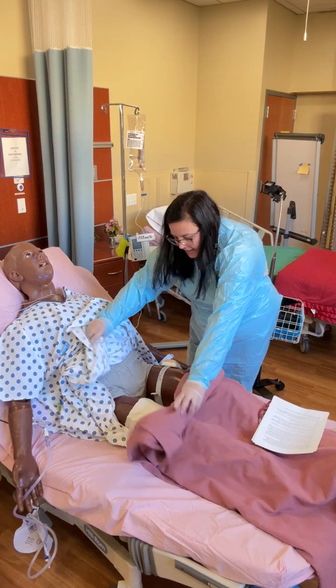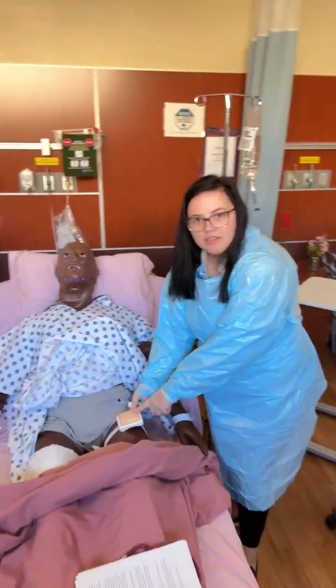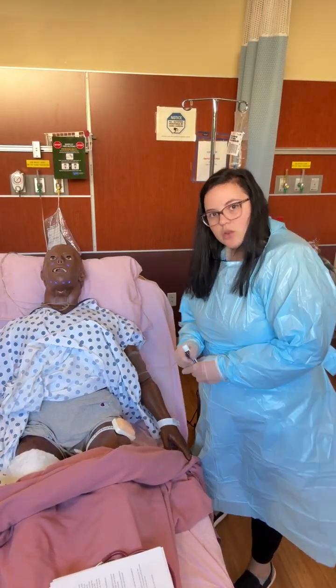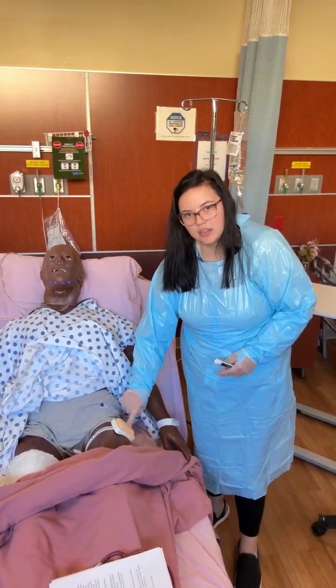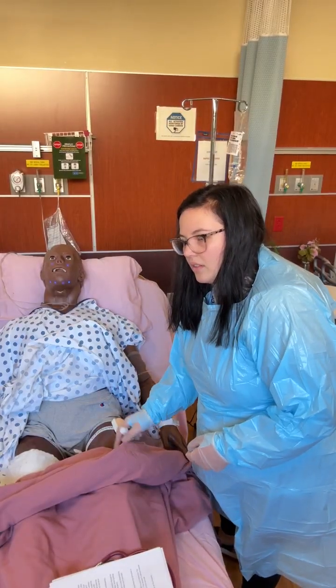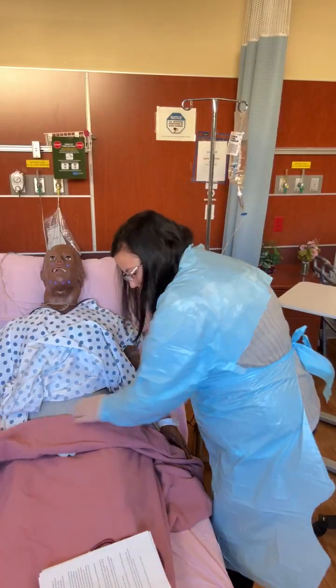So if you needed to give any injections, right here you can see this little pad. You won't inject anything into the simulator, but you can inject into this little task trainer right here. It is an IM.